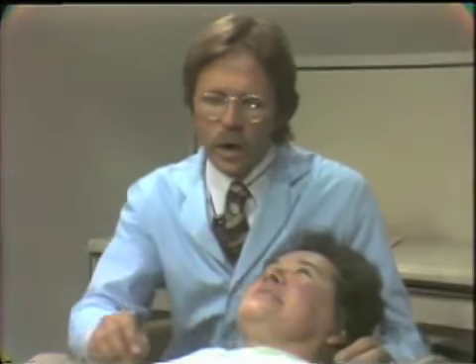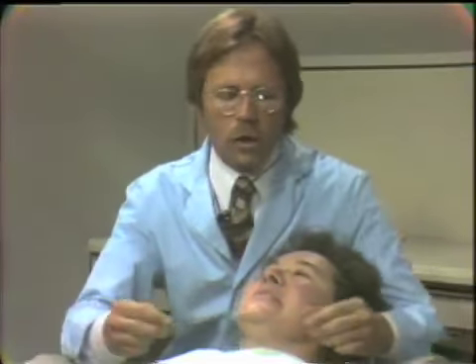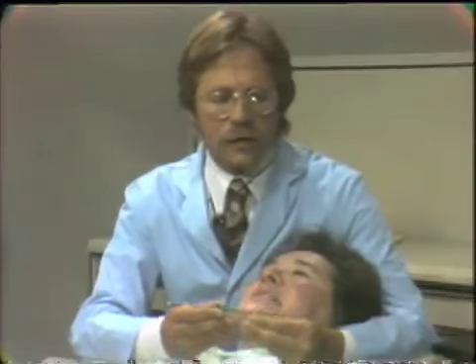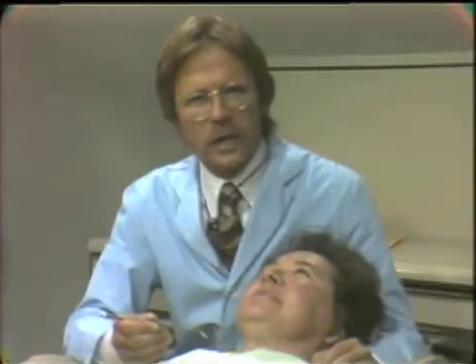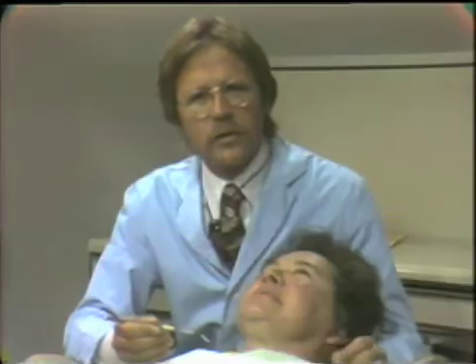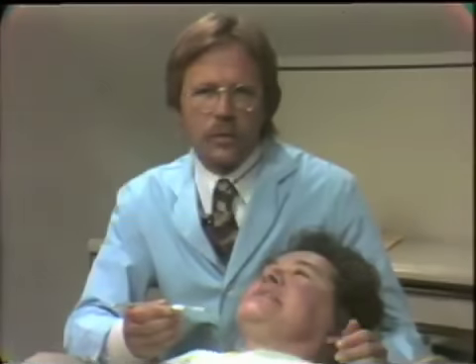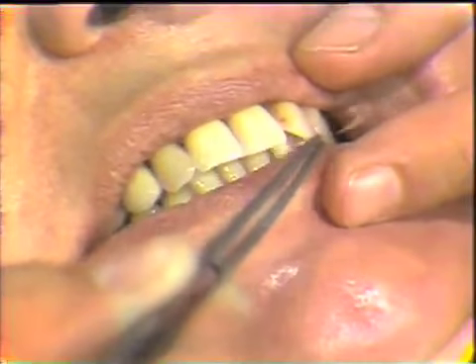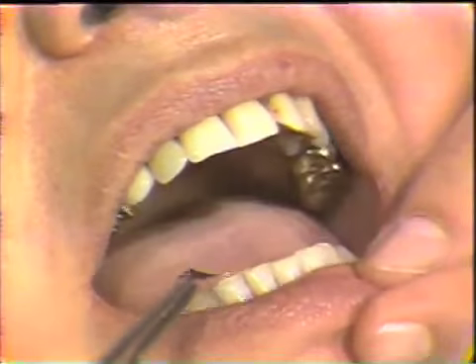Now, one other thing we'd like to record before undergoing any type of occlusal procedure would be, in the centric occlusion position, whether the patient has contact or not. This is a good indication. Perhaps you could do this now and after the time of the occlusal adjustment procedure, but they should be recorded prior to abutment preparation. This is so we know whether the patient had a contact on the tooth. Open, close. There's no contact there. Open, close, open, close.